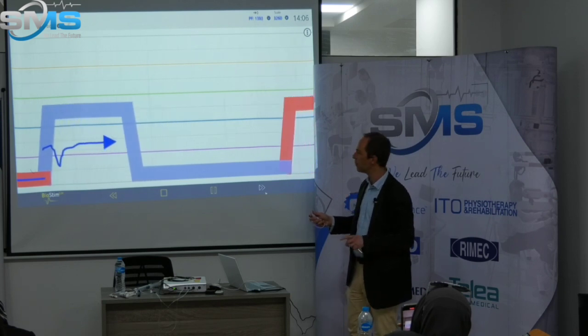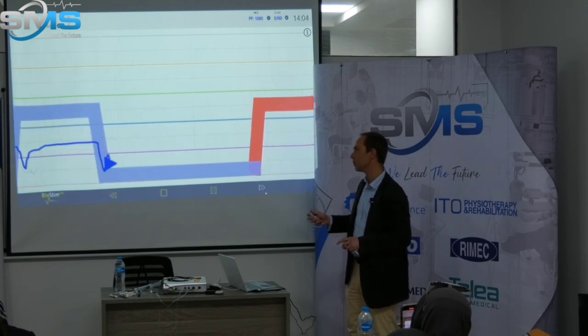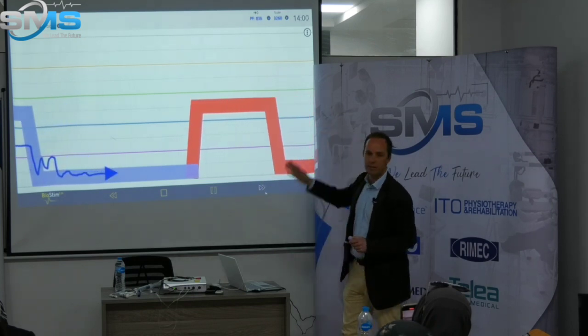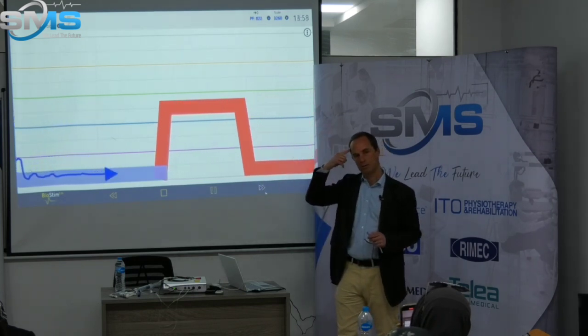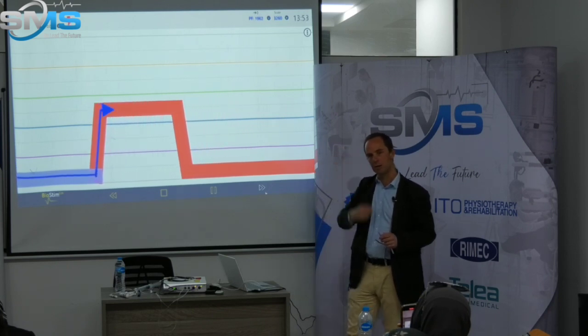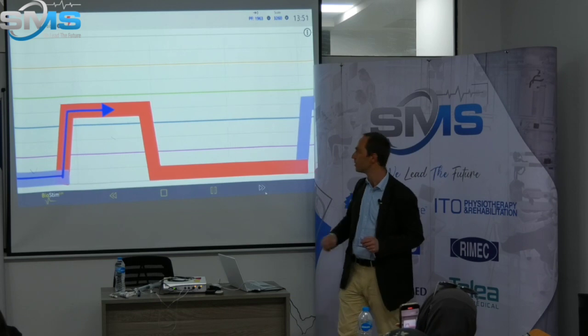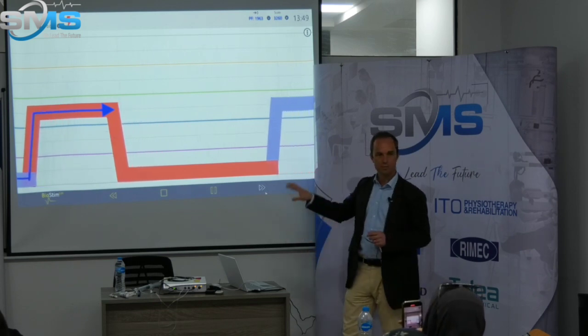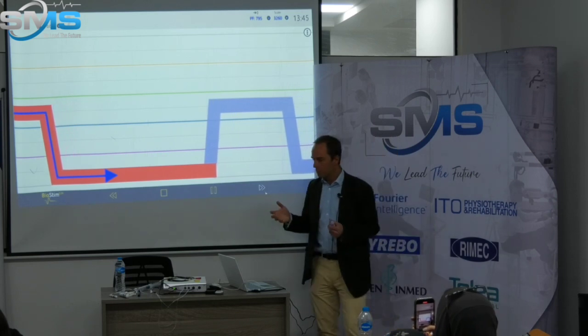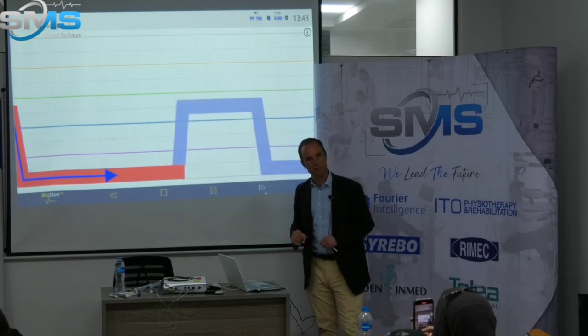Not perfect, but better. Oh no, yes, that was not so bad. But after 3, 4, or 5 turns, there will be a connection between how to contract this very specific muscle, and it will work. So that's a very good interest of this for a good proprioception.